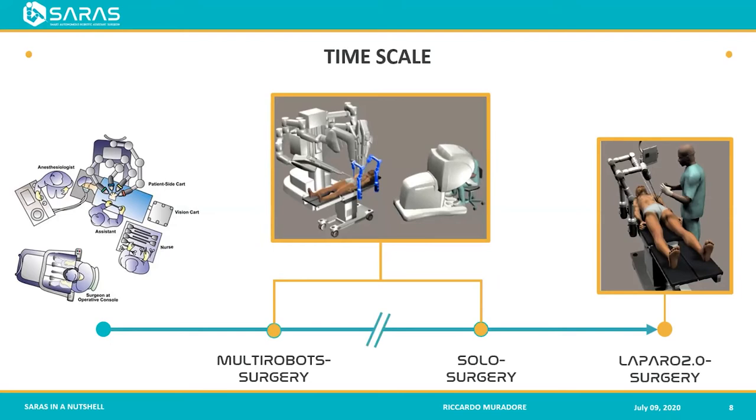To go to this platform, we developed in the first 2 years of the project what we call the multi-robot surgery. In this platform, the assistant is not using directly the laparoscopic tools, but he or she is controlling remotely the laparoscopic tools mounted on the robot using a haptic interface. And this is quite important, because if you need to collect useful information from this video, you need not only to collect video streaming as in the data set we are talking about in this event, but also the kinematics of both the arms controlled by the main surgeon, and the kinematics of the laparoscopic tools controlled by the assistant.